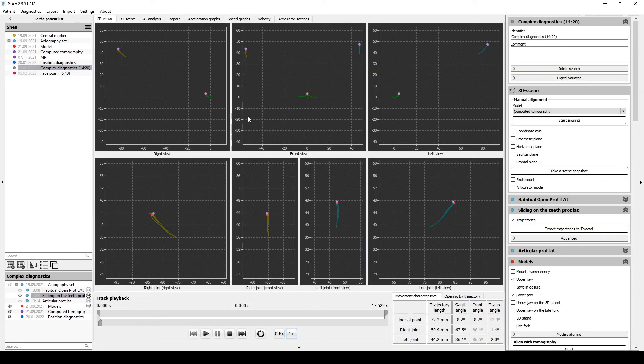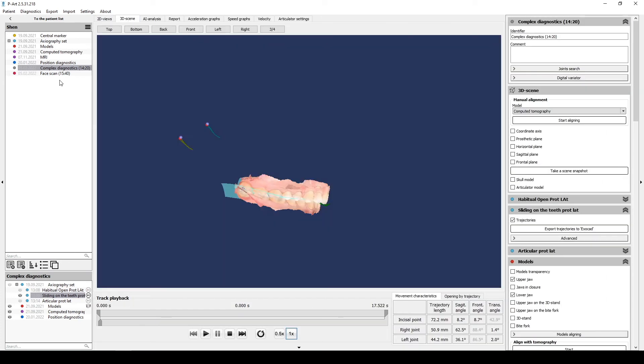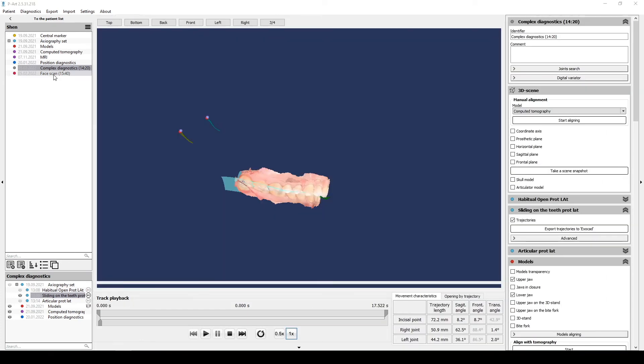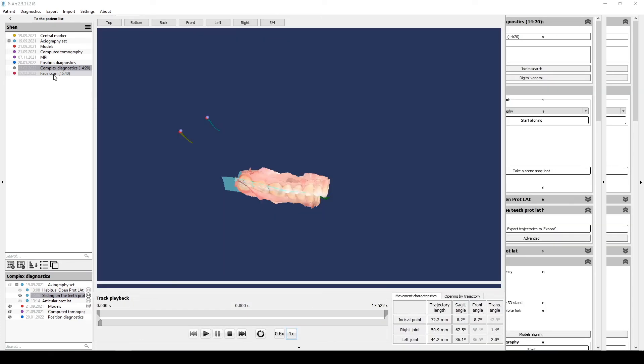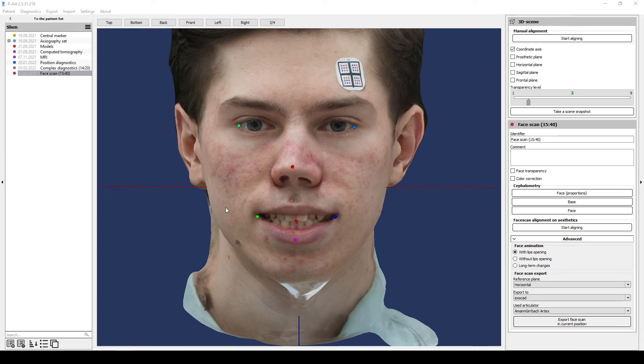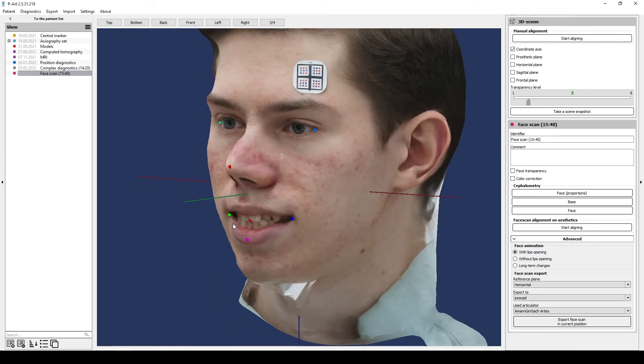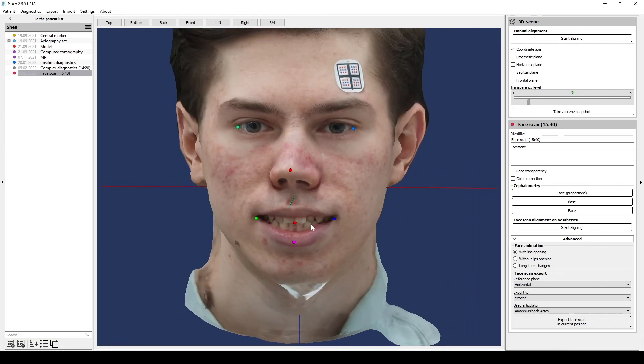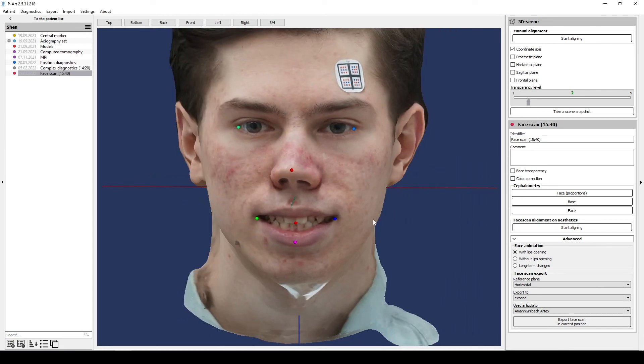Also you can export face scan. For that you need to open section Face scan in the right menu. It is marked with a red circle.